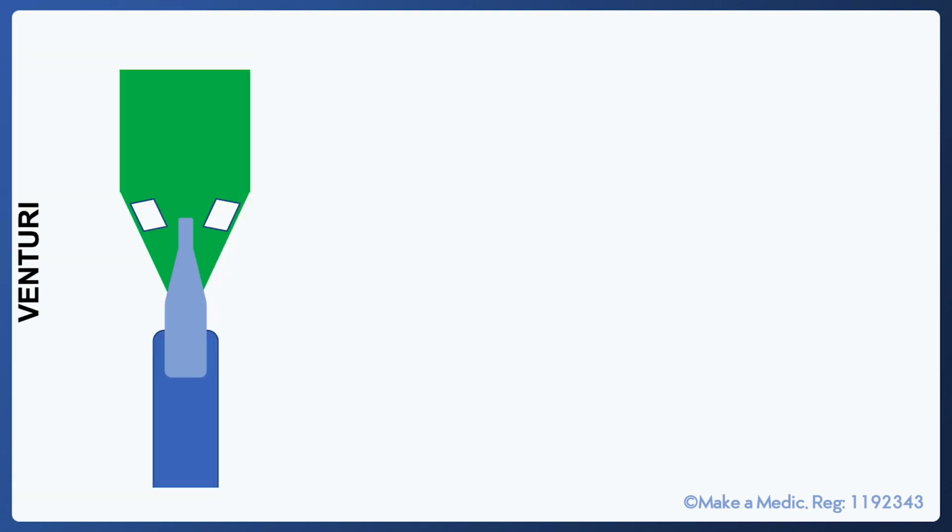We mentioned earlier how a Venturi mask is a fixed delivery device where you can control the FiO2 achieved. It's achieved by utilizing some clever laws of physics. At the bottom end, a certain amount of oxygen will be passed in via the tubing from the wall. If you look on the side of each Venturi device, it will specify the flow rate that should be applied. It varies depending on the FiO2 achieved by each device. Ignore the green color of the Venturi in this diagram. Let's pretend that this Venturi is designed to achieve an FiO2 of 24%.